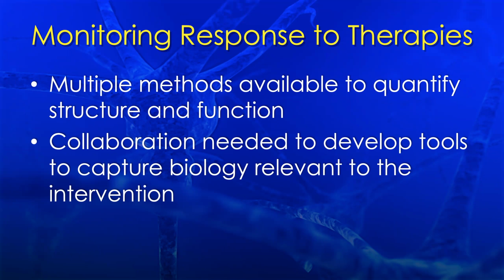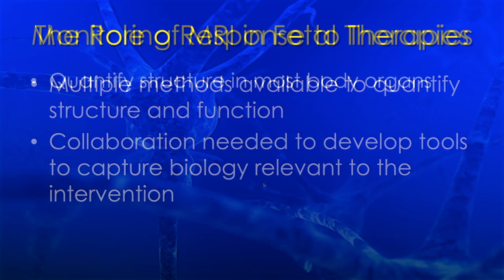Because we need to target the key things you are looking for to diagnose a specific abnormality that you want to treat, and to see if we can pick up immediate responses, or at least longitudinal responses over time while in utero, so we aren't always complicated by waiting for 18 months to get, say, follow-ups at 18 months of age.